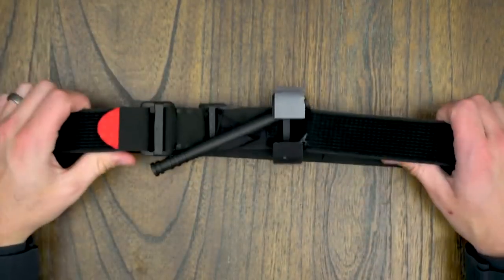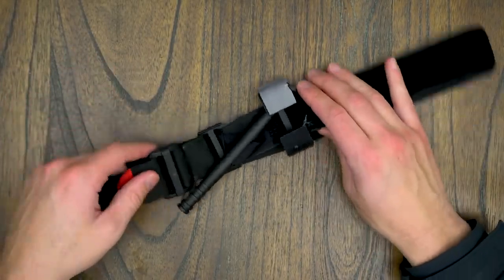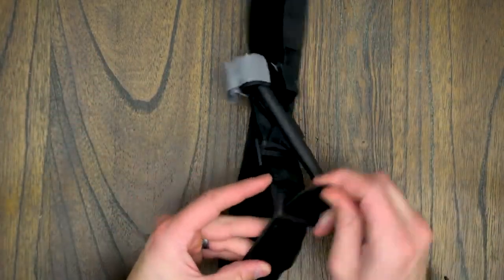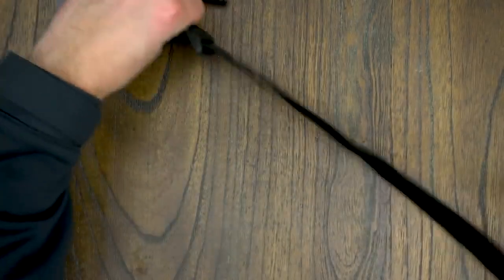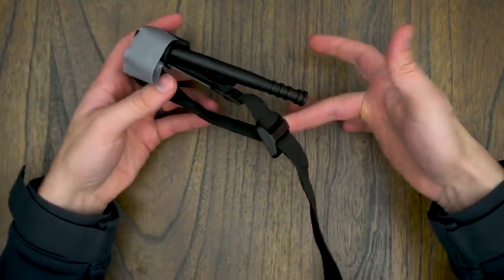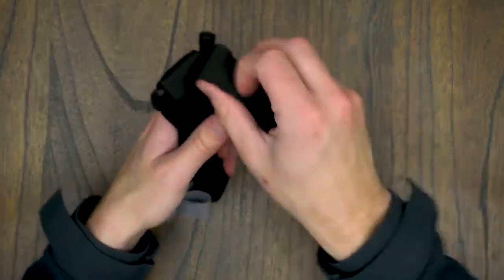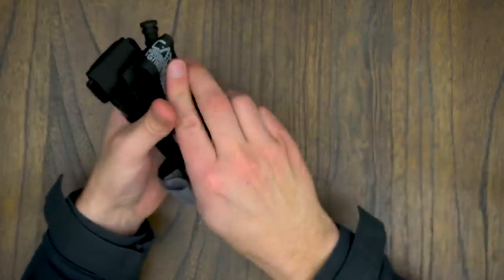Now that I've shown you the right ways to stage tourniquets, I want to show you some of the big problems I've seen and talk about why these are issues. So the first thing I see a lot of is people get a tourniquet and they pull it tight to store it. So they have a loop through here, they pull it tight, and then they just accordion fold the rest of the tourniquet back on there.